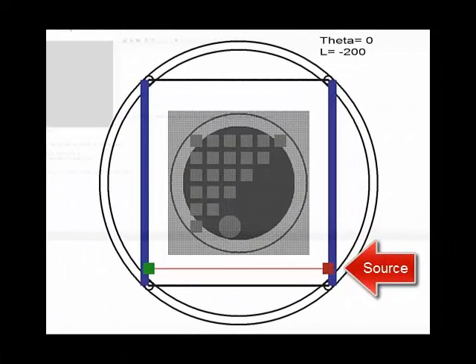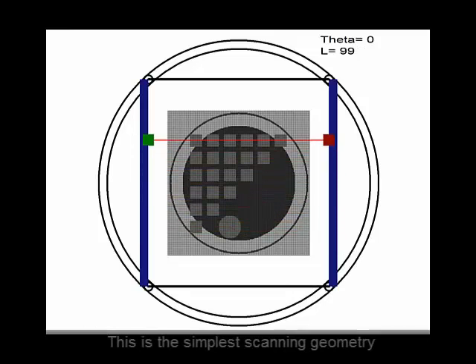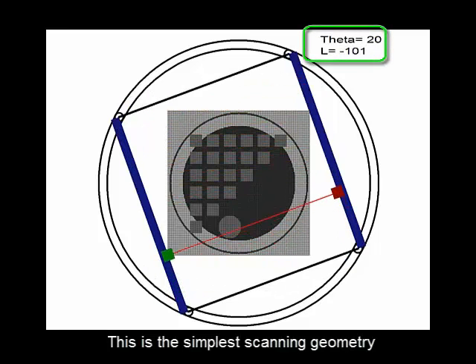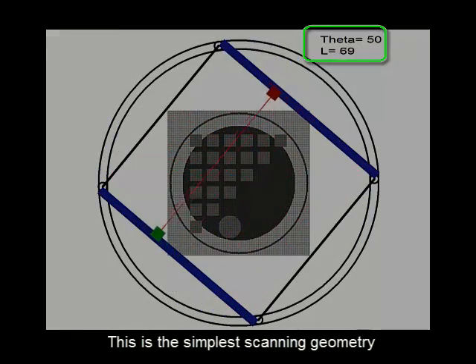The scanning geometry is achieved by having an X-ray source on a rotating gantry. The source can translate along the gantry. A detector follows the X-ray source. There are two variables related to the scan: rotation of the gantry and the progression of the source along the gantry.